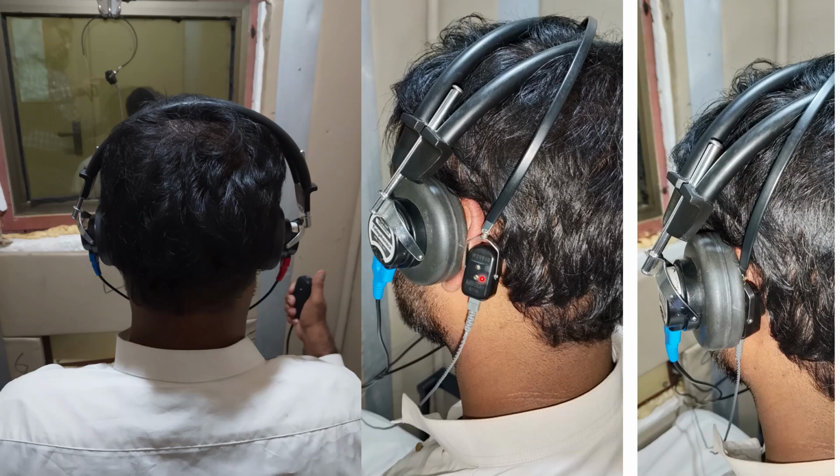As in this patient, the bone vibrator is on the left side, so the right side earphones will be producing the masking, and the patient will be asked to press this button whenever he hears the sound on the testing side.